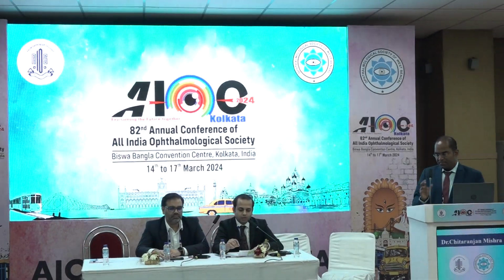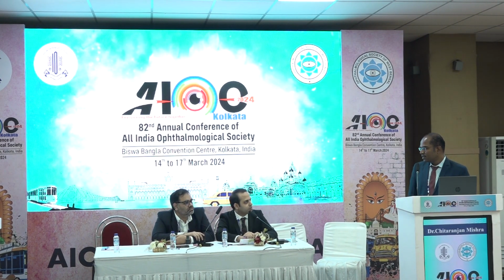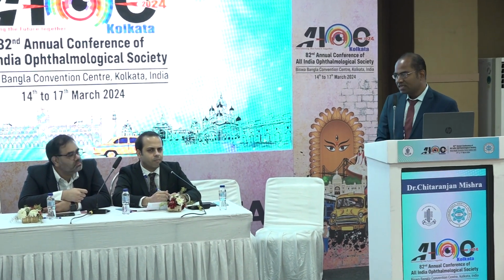Thank you so much, Dr. Chitaranjan, for such a nice presentation. Have you ever tried using your phaco probe without a sleeve? That has also been described for lensectomy. Yes, I agree, that's why I mentioned it in the discussion. But because I am a posterior segment surgeon, my presentation was mostly on the vitrector, so that one I have not tried. But yes, people have done it and described it.